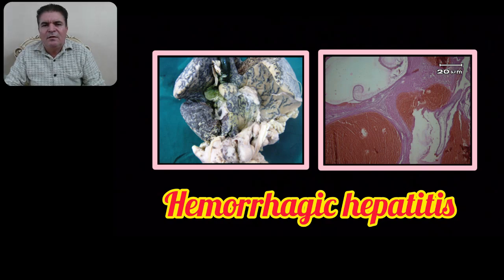In the name of God, the Beneficent, the Merciful, and my case presentation is about hemorrhagic hepatitis.